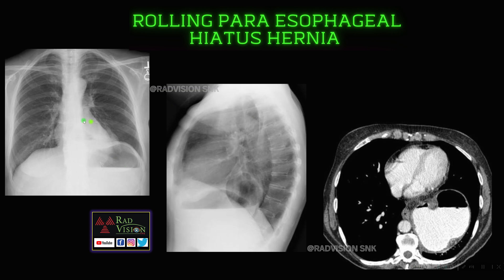Next, you can see a retrocardiac density with air-fluid levels. Here also you can see air-fluid levels in the retrocardiac region. There is the stomach herniating into the thorax in a paraesophageal location — this is a rolling paraesophageal hiatus hernia.